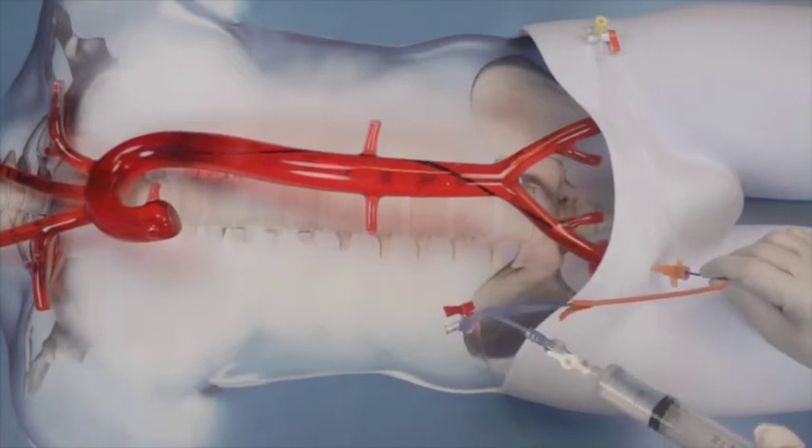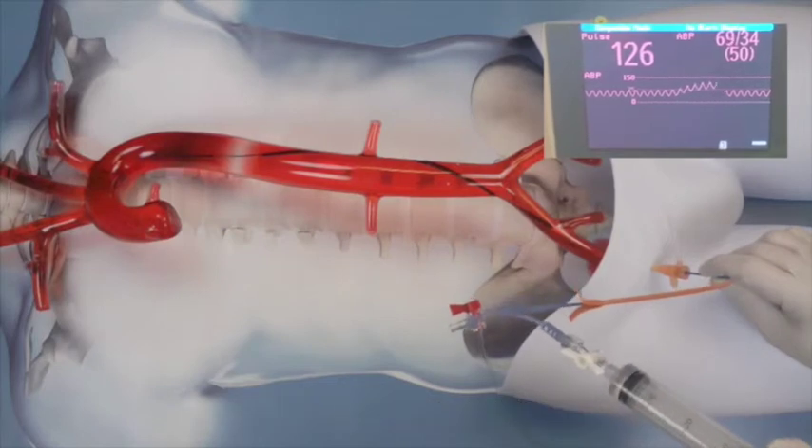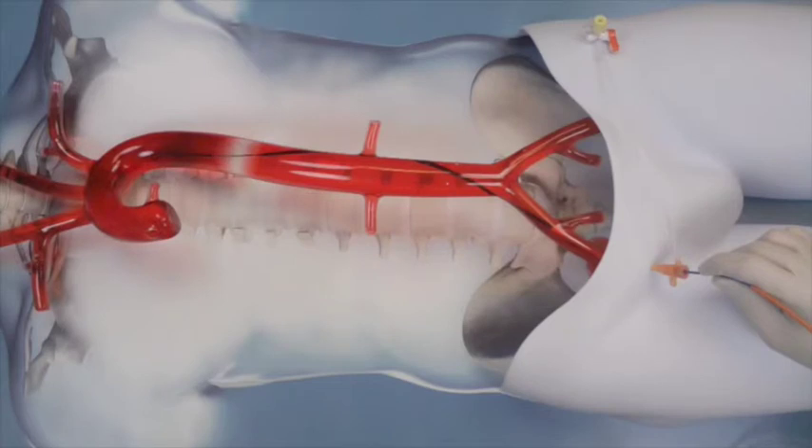The balloon is then insufflated, and if the arterial line is utilized, you should see a very gratifying response in the pressure above the balloon for those patients who will respond to REBOA utilization.